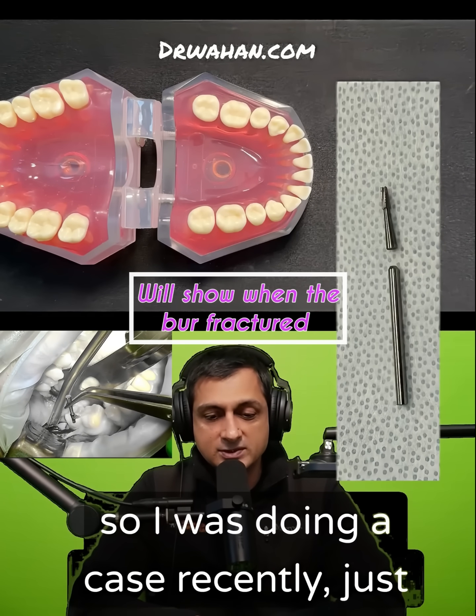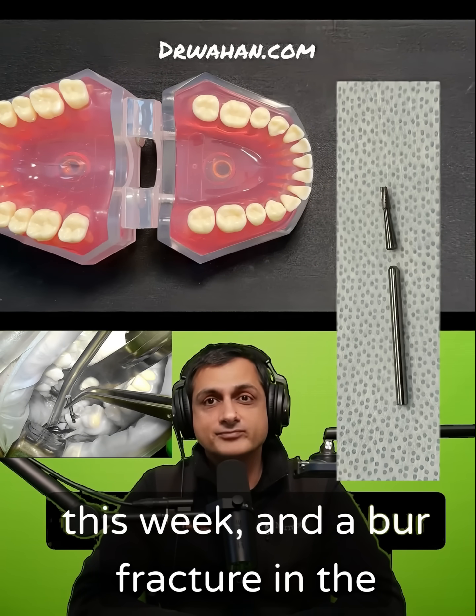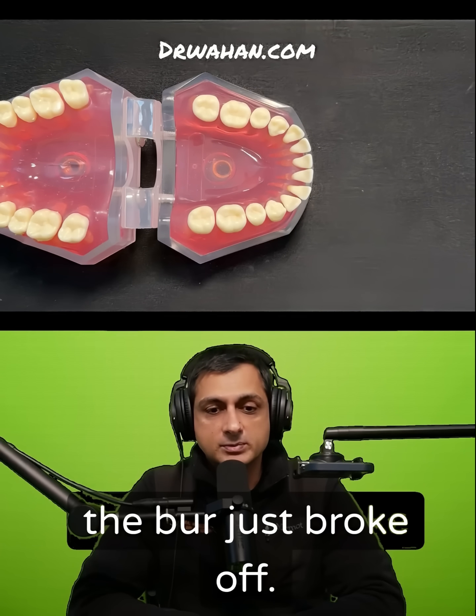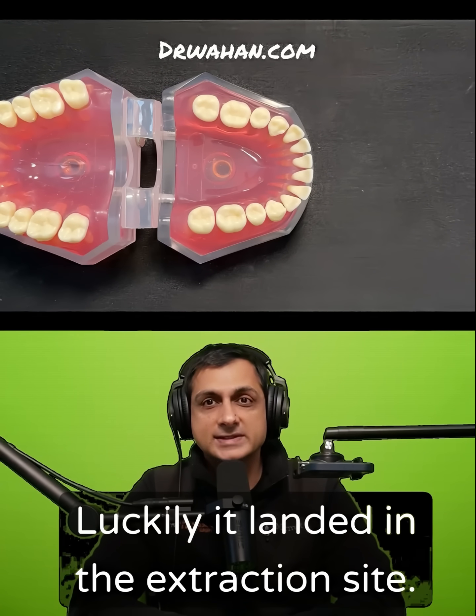I was doing a case recently just this week and a burr fractured in the middle of surgery. I was making a buccal trough and the burr just broke off. Luckily it landed in the extraction site.